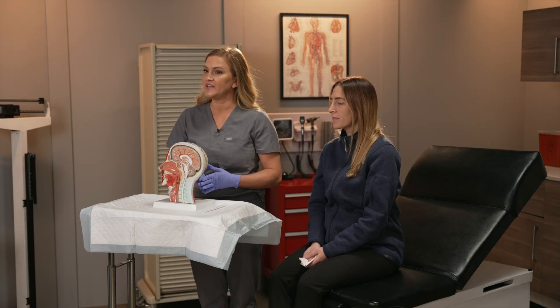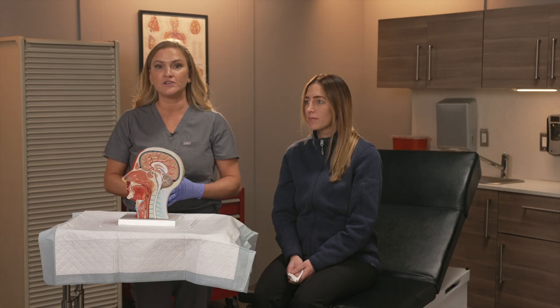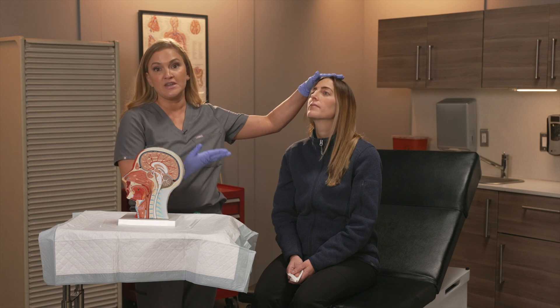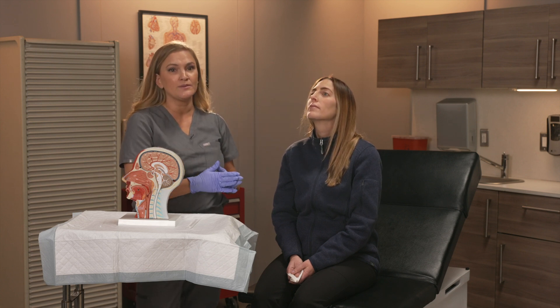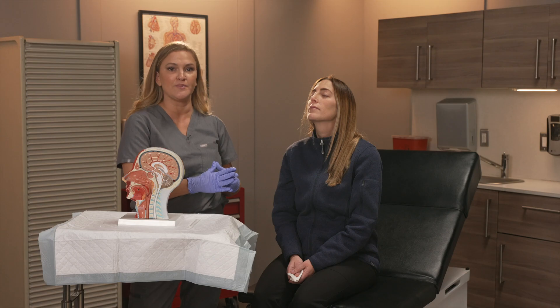Proper positioning is key to obtaining a quality sample as well as ensuring patient comfort during the procedure. I like to start by tilting the patient's head back slightly so that the nasal passage is becoming more accessible to you. Warn your patient they may sneeze or tear up during this part — warning them is key to facilitating the ability to get that perfect sample and ensure your patient is comfortable and prepared.